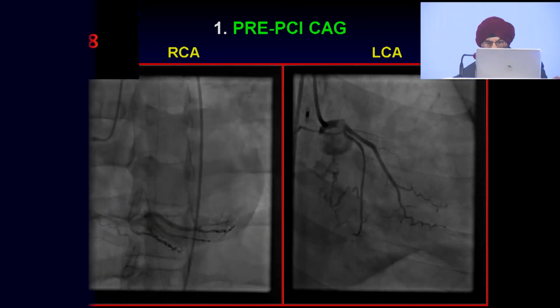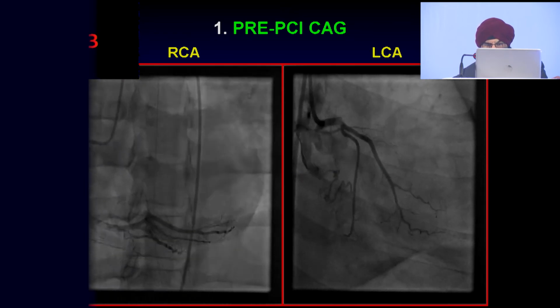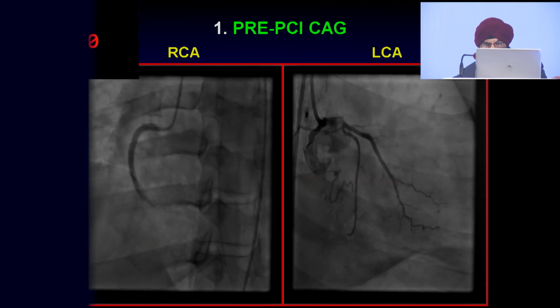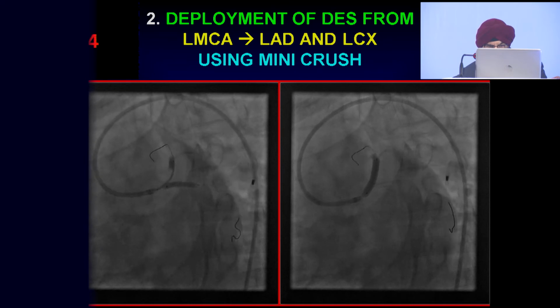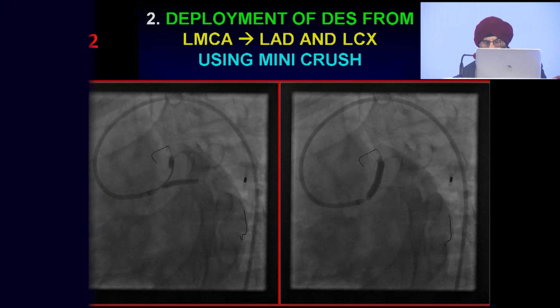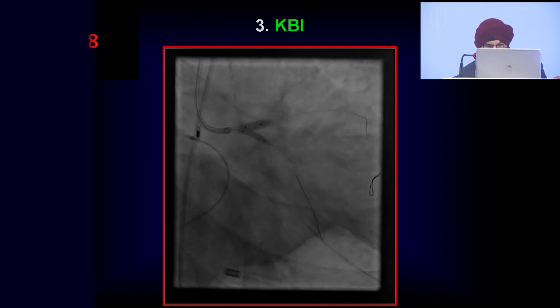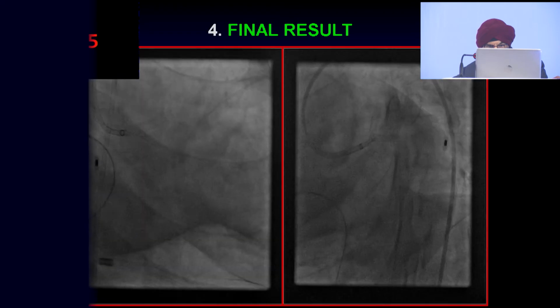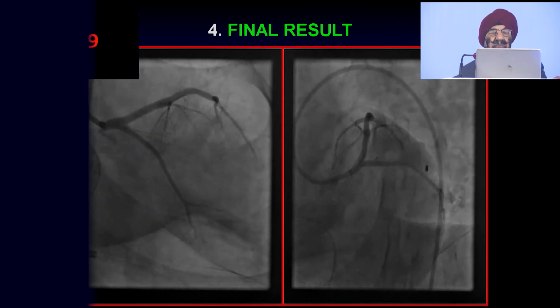Right coronary artery was okay, young man, but you can see that there is a ruptured plaque with a thrombus in the left main with some flow maintained in the circumflex OM, but LAD is 100% occluded. We did not lose any time in cannulating this LAD, but we were very concerned about this OM also, because if we lose this OM, the patient would die on the table. So we did a mini crush. I took 2 stents, one in the LAD, left main to LAD, and the other one in the circumflex origin, and then did a kissing balloon inflation. All this with a blood pressure of 80-90 and augmented pressure about 120 on IABP.